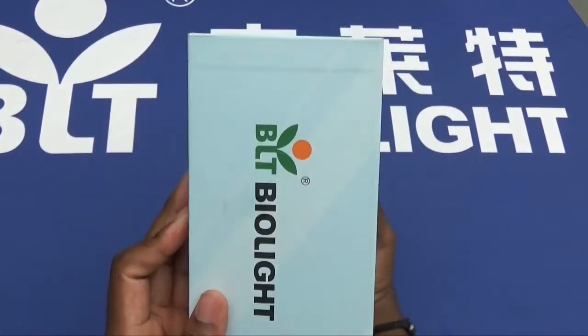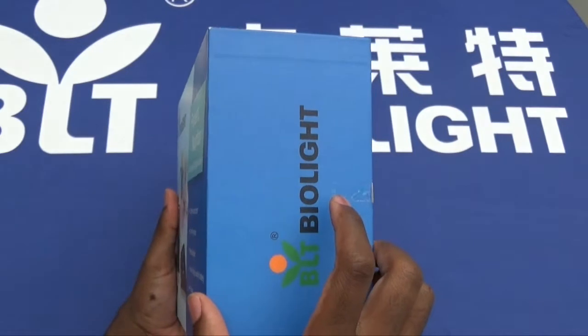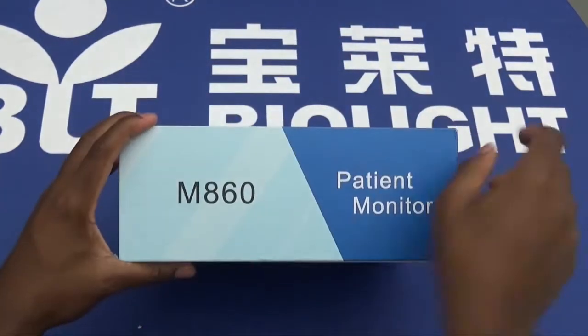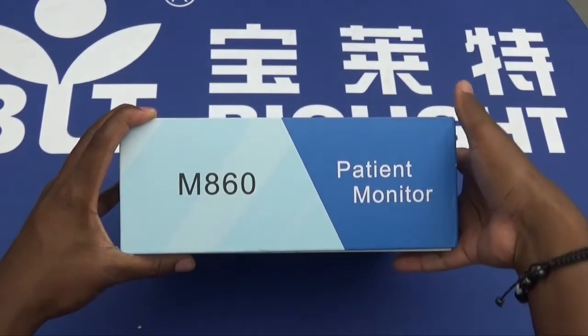Looking at both the left-hand side and the right-hand sides of the box, we have a Biolight logo and the Biolight tag. At the bottom of the box, we have the M860 device number and the patient monitor tag.